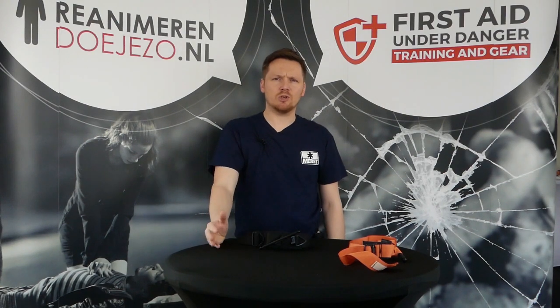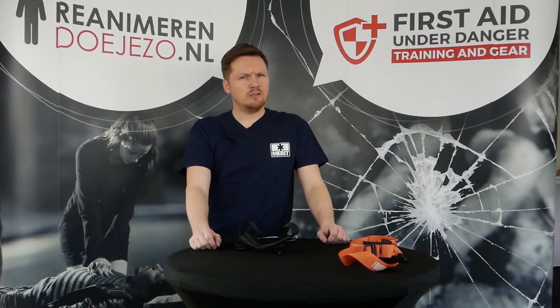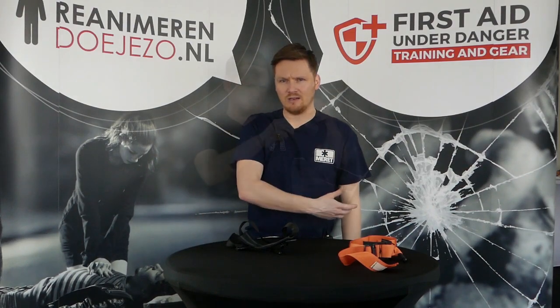If somebody puts a tourniquet on their arm to make a statement, they always do it like this and like this. And that is something you will not do if you're really hurt, or if you have, for example, an amputation by an IED. You won't be wiggling your arm around a lot by yourself. So let's see what the possibilities are if I just leave it like this.